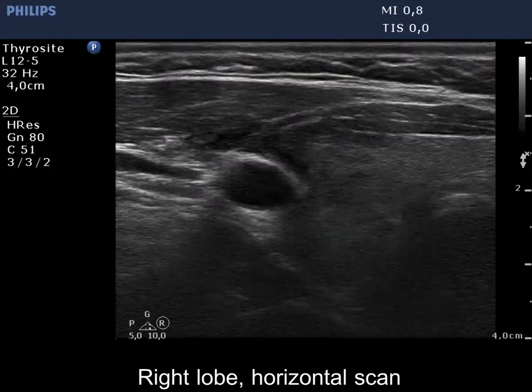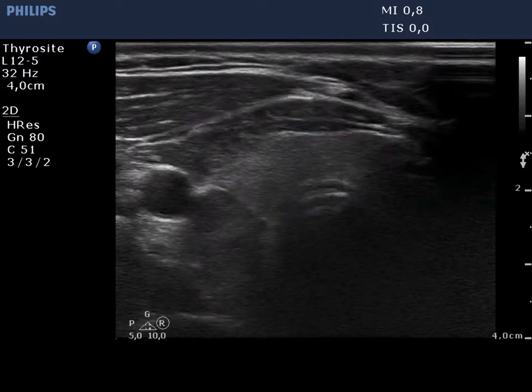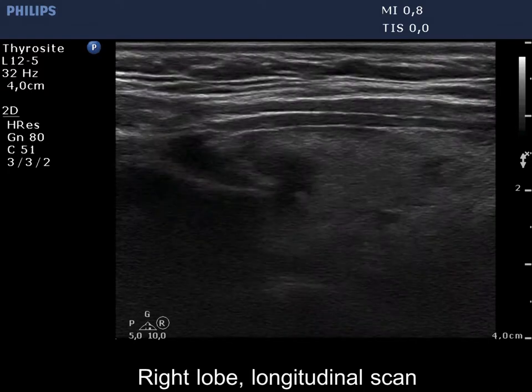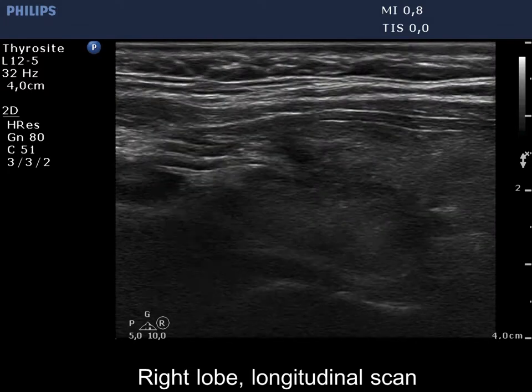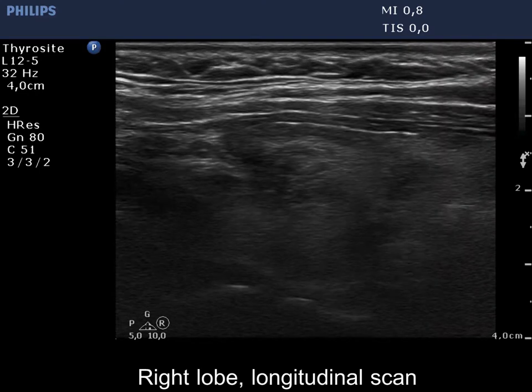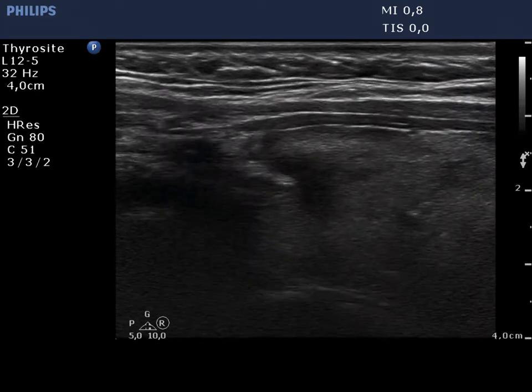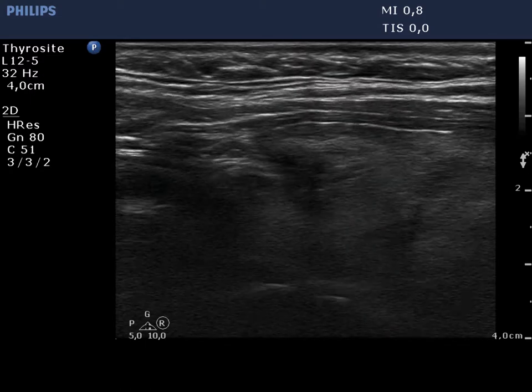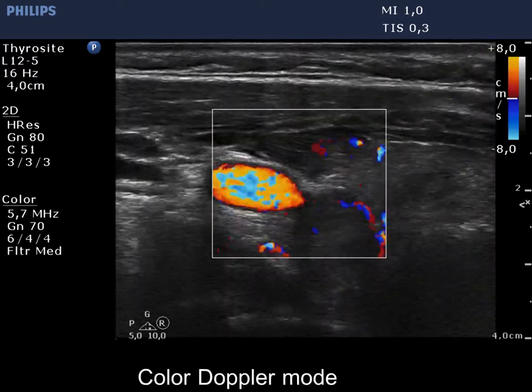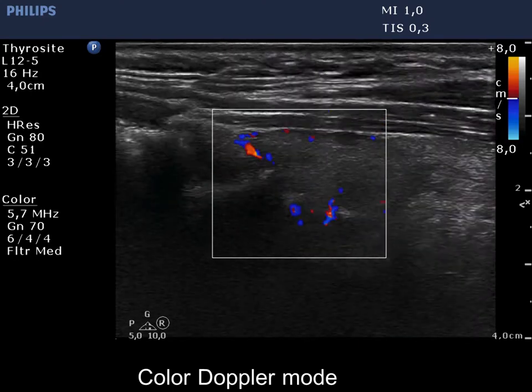The right lobe is ecnormal in present small hypoechoic discrete areas. The lesion in the upper third has partly lobulated, partly ill-defined margins. Note that the tumor is in very proximity to the edge of the lobe at the ventral lateral part. The vascularization is not specific.